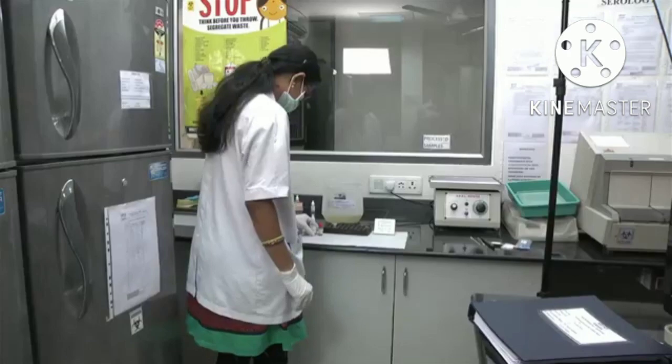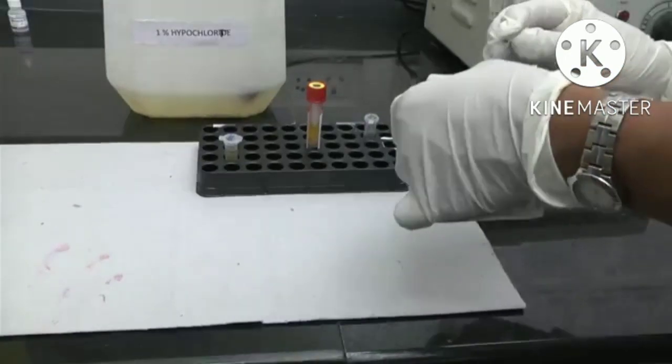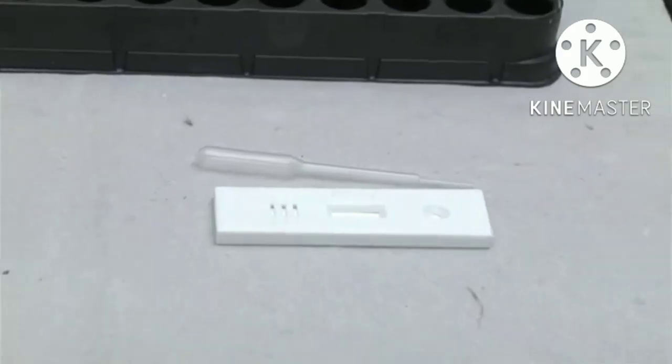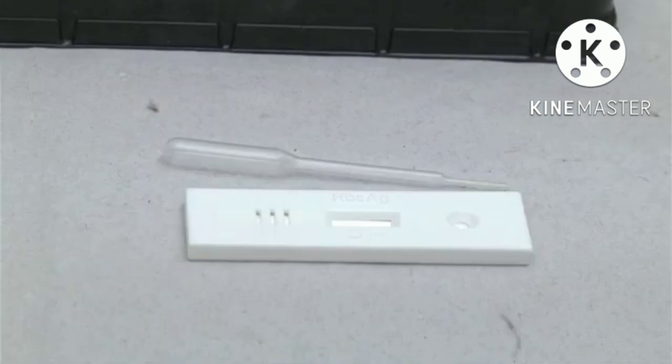Allow the test device and specimen to equilibrate to room temperature prior to testing. Remove the test device from the sealed foil pouch and use it as soon as possible. Best results will be obtained if the assay is performed immediately after opening the foil pouch.